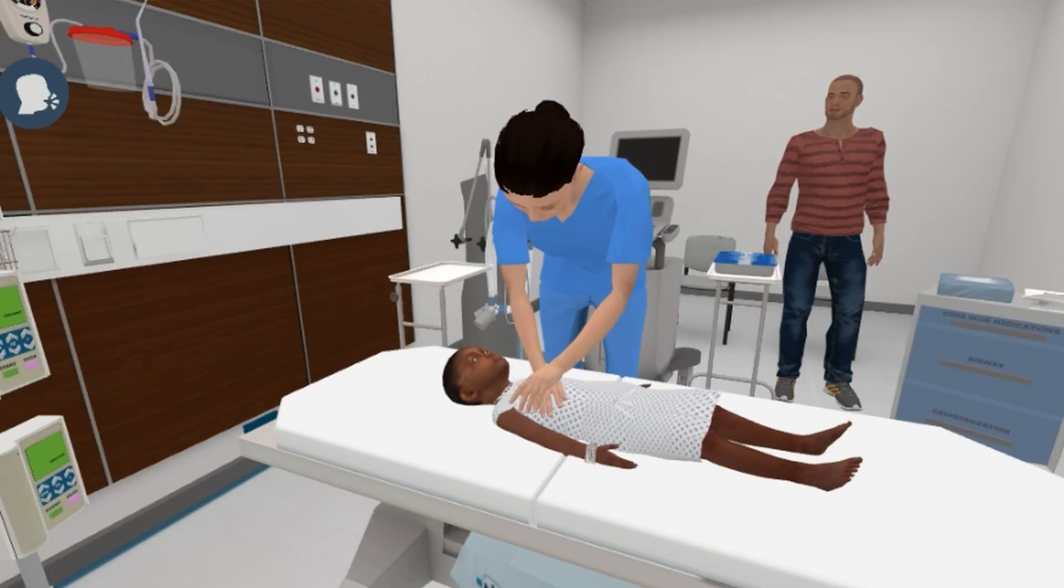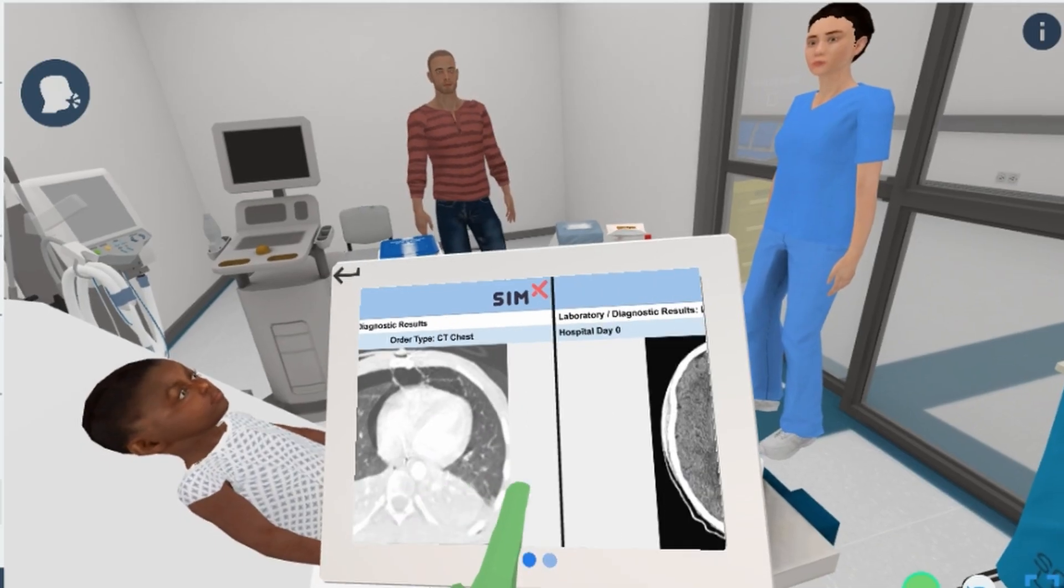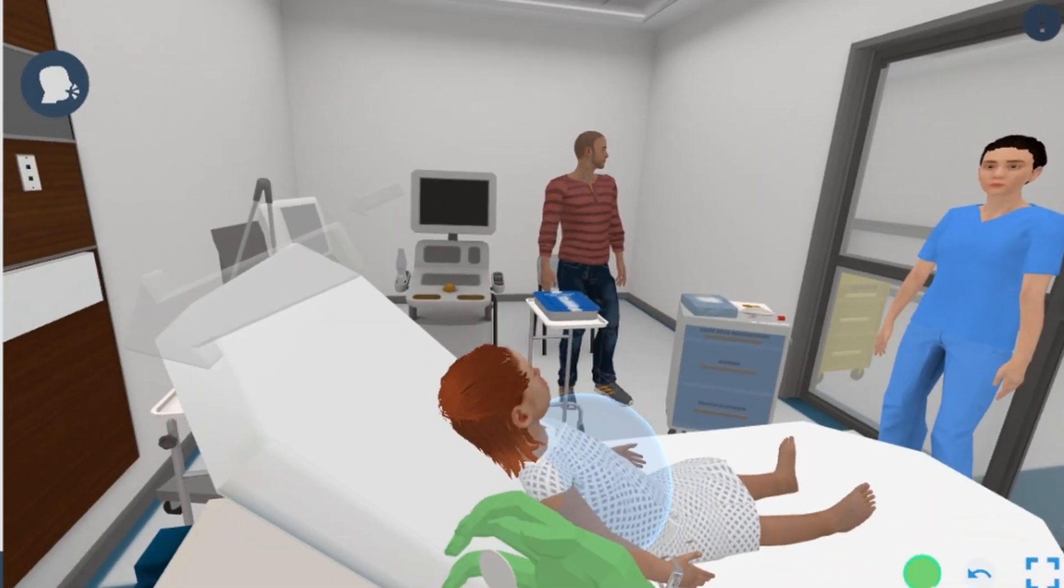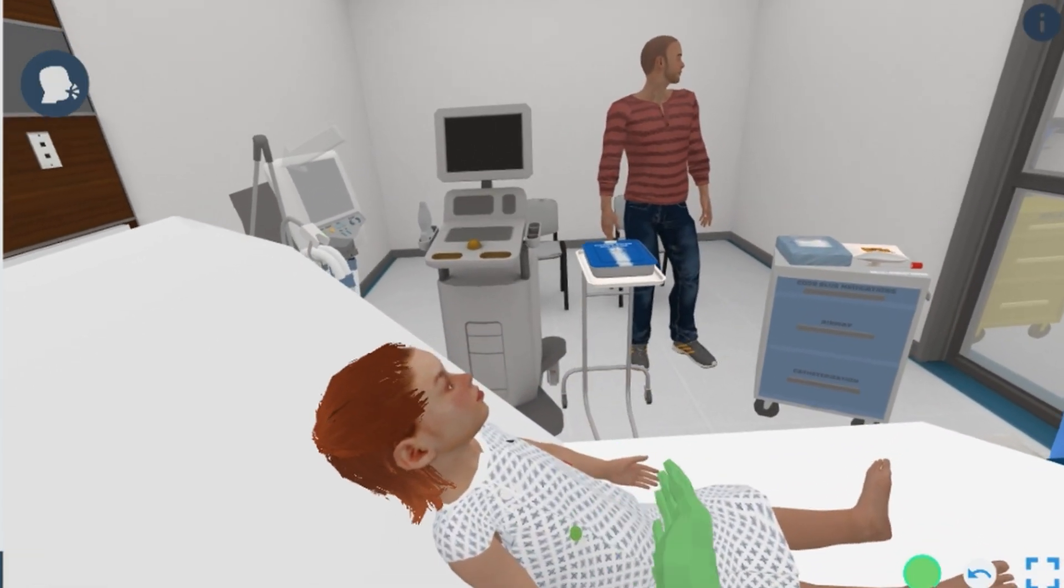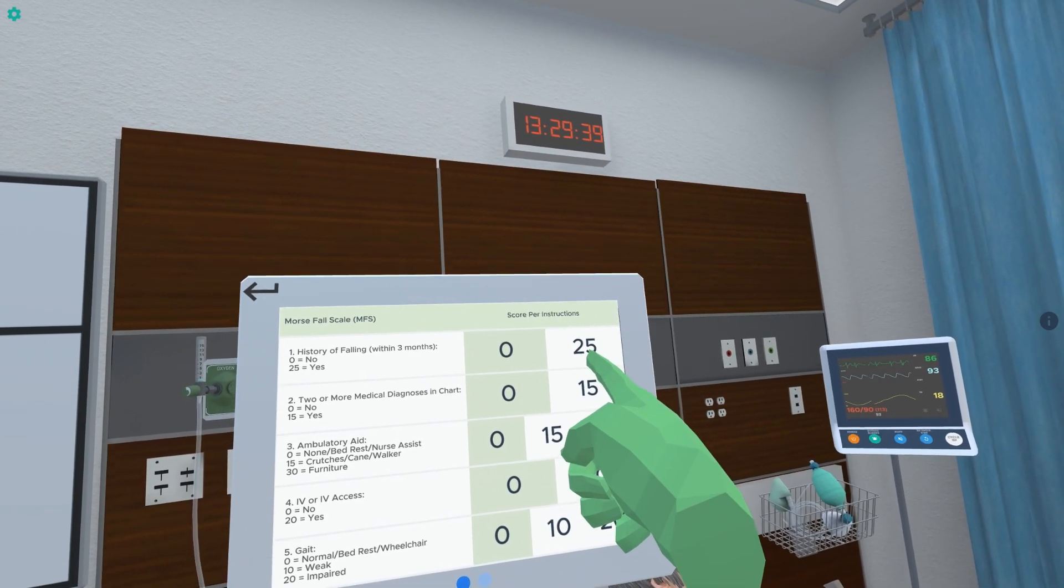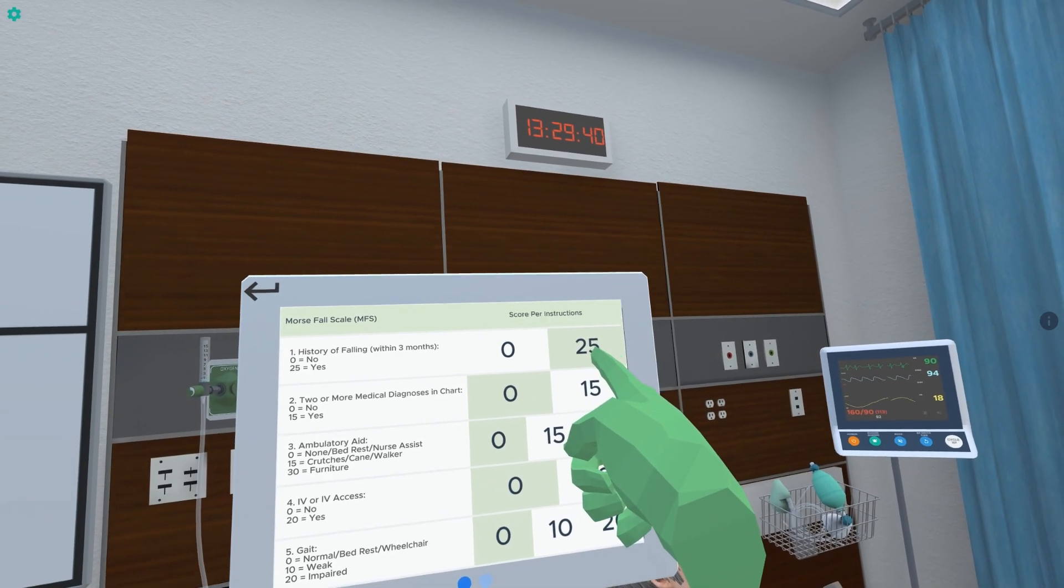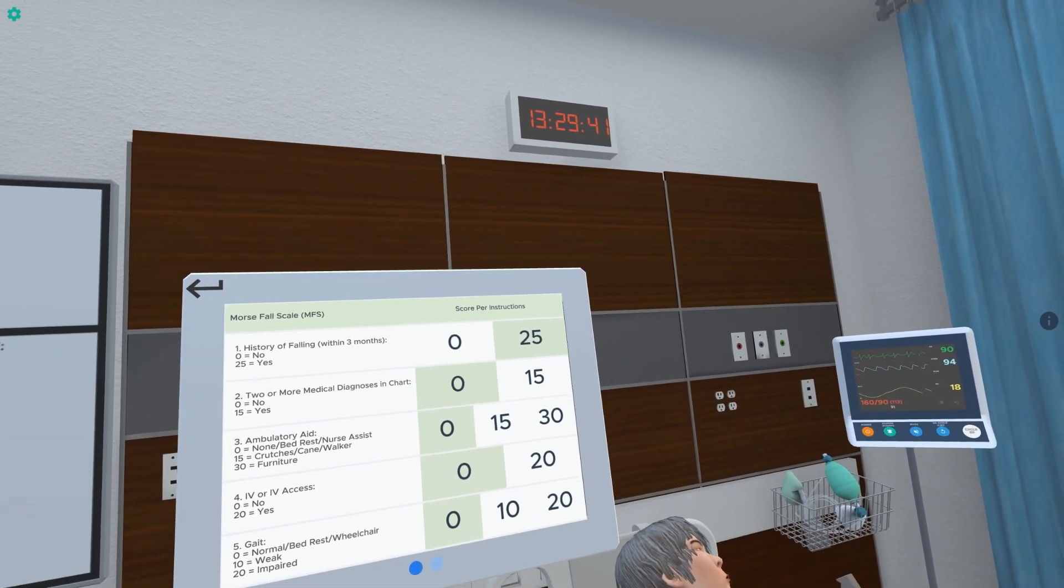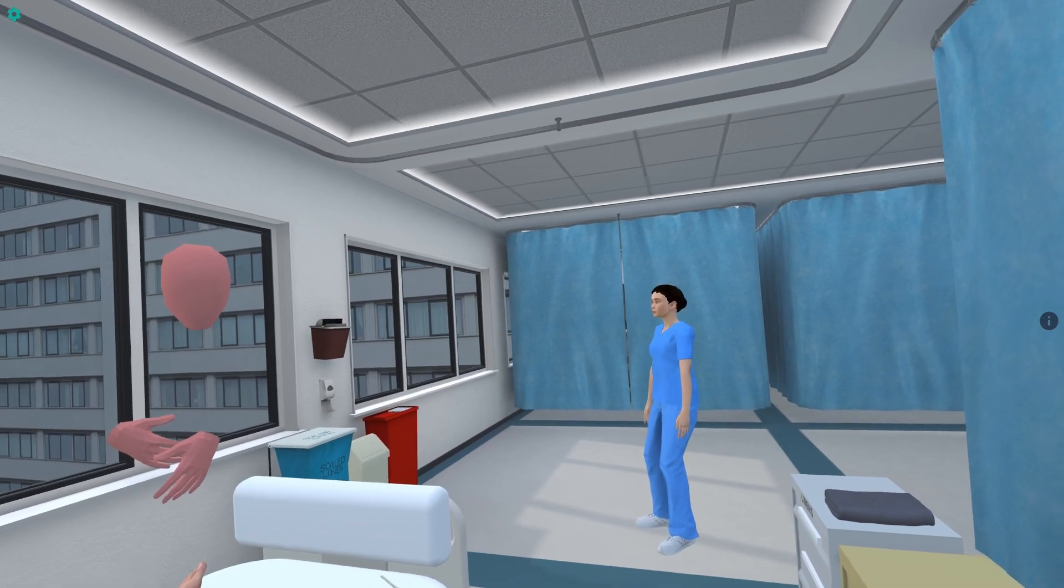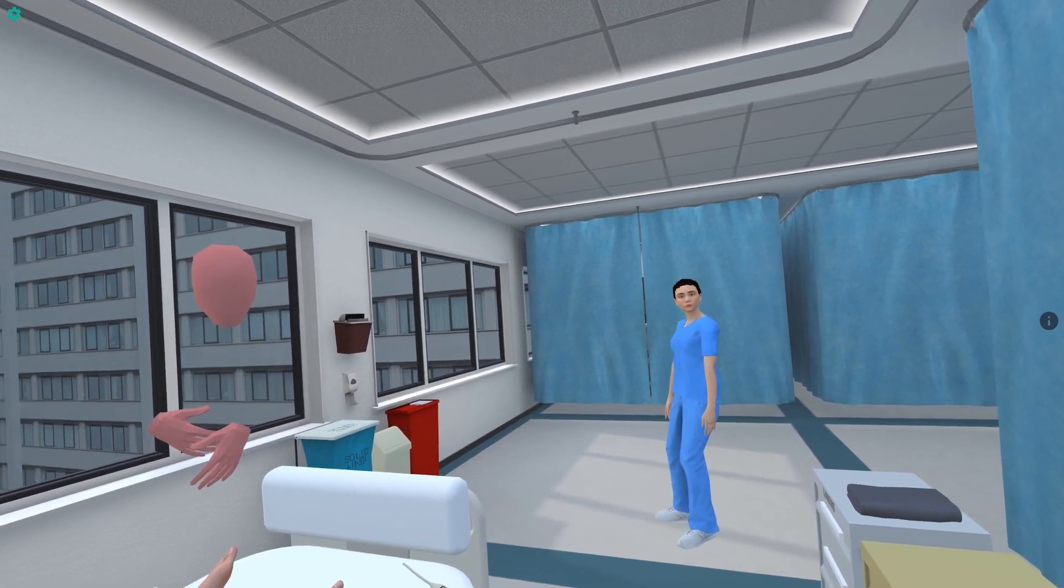The SimX Virtual Mannequin Series with custom case creation technology is revolutionizing medical education worldwide. Building a fully customized realistic simulation has never been easier or quicker.